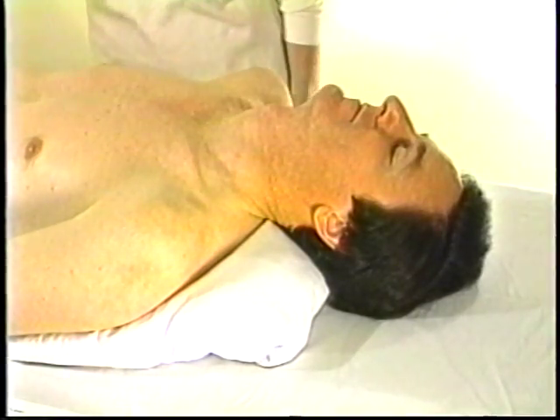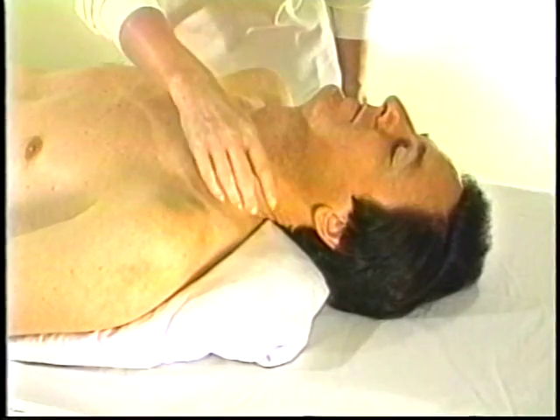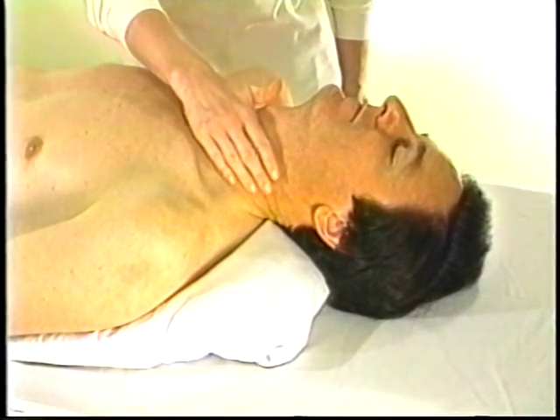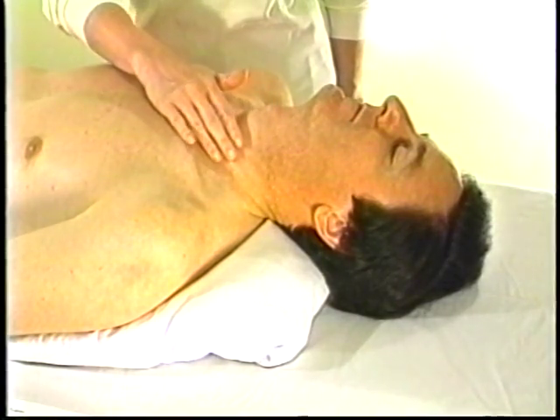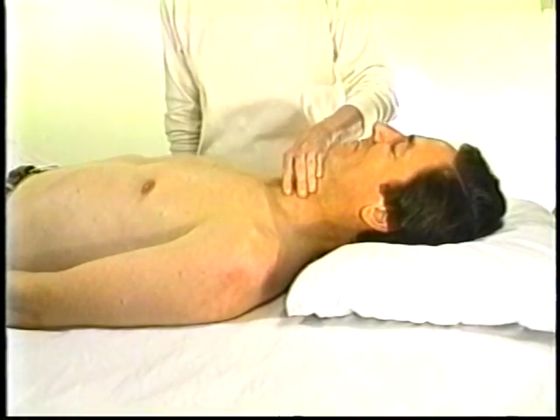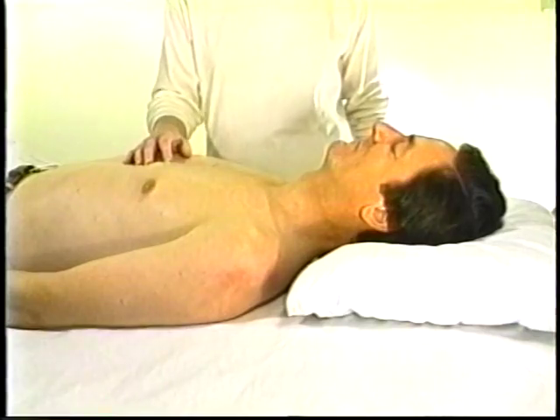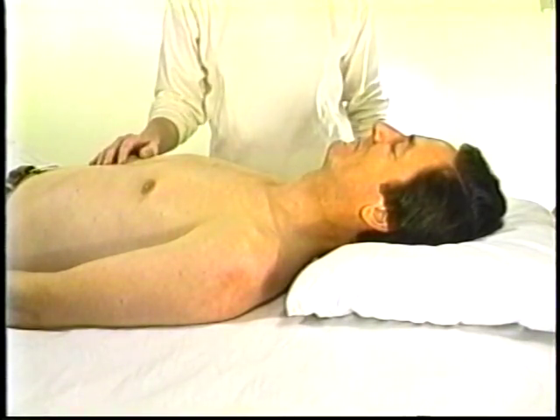Some anatomical sites carry special challenges, and the thyroid gland is certainly one of them. Several factors are important for success. The first one is the position of the patient. Hyperextension of the neck created by a pillow under the neck and shoulder area usually makes it more difficult to access the mass. This is because both the skin and the muscles become stretched and firm, hiding any deep-seated nodule in the neck. In my experience, it is easier to hold and palpate a nodule when the neck is relaxed. This can be achieved by laying the patient down flat or by putting a pillow under the patient's head.